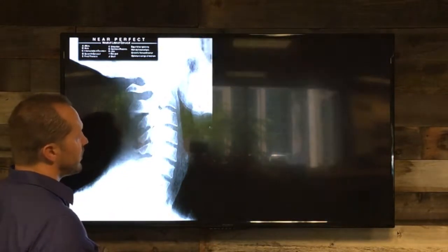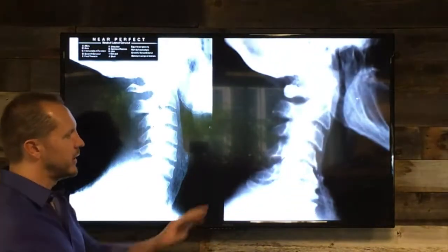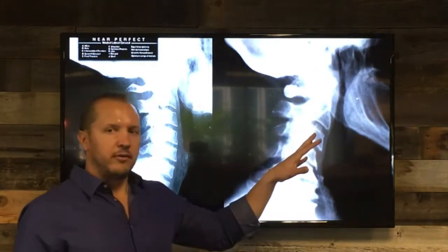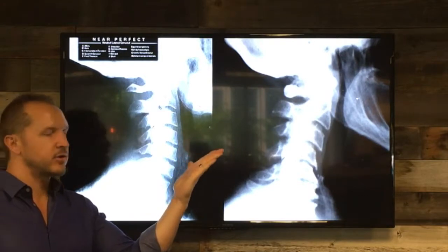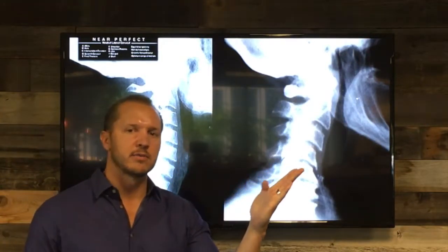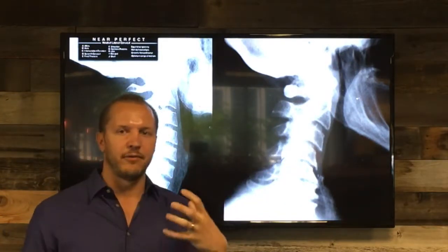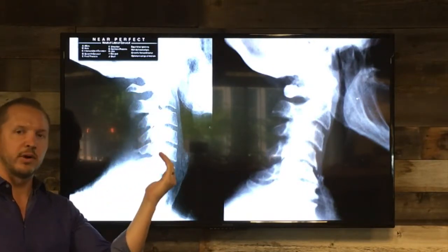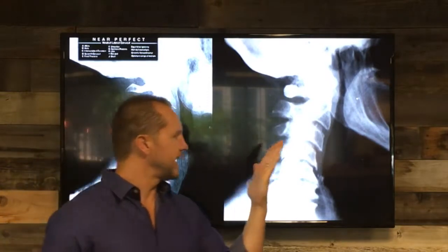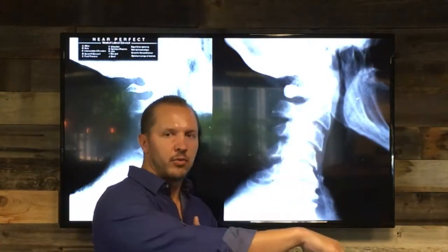So moving forward, here's another example of a degenerative neck. So this neck, you can see, not only has it lost its curve, it's starting to curve the opposite direction. This is what we call a cervical kyphosis. A cervical lordosis means you have the proper curve going the proper direction. A cervical kyphosis means it's actually flexing the wrong way.